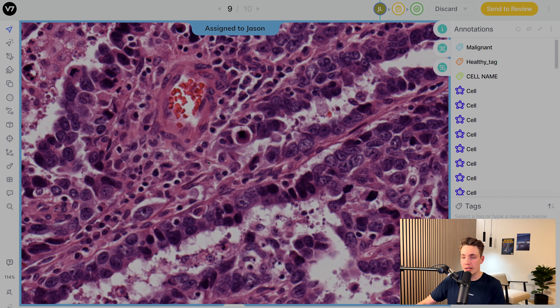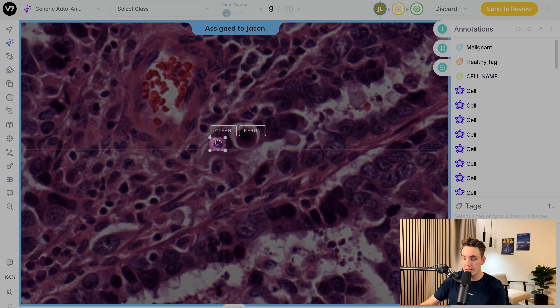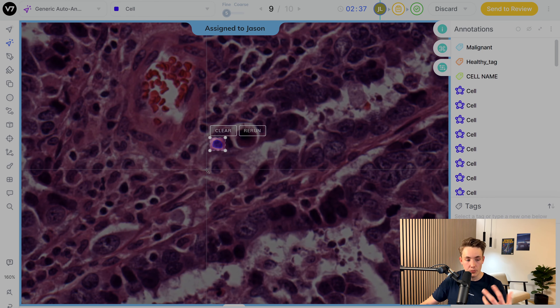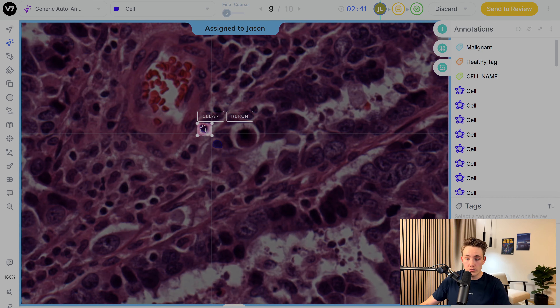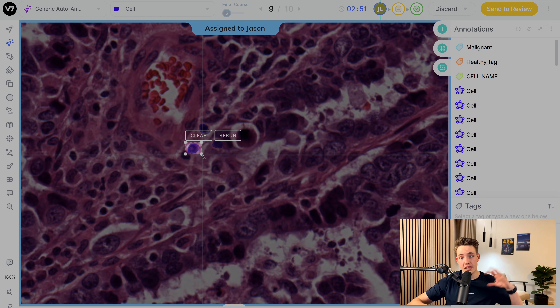I'll zoom in a bit and then use the auto-annotation tool. I'll go down, find the cell we want to annotate, and draw a bounding box around it. Then we choose the class — we'll go with 'cell' and it will figure things out from there. We can keep drawing bounding boxes around all the cells we want to annotate. When we have enough data, we go in, train our model, run it in V7, and then feed new data into the model — it can do auto-labeling on the whole WSI image.